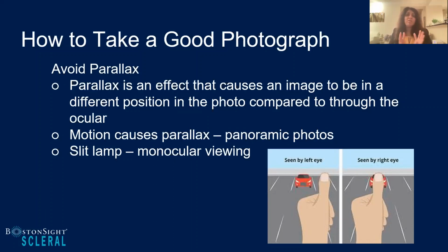The most important thing to know is that when you are looking at something through the slit lamp, take your image and then look at your image to make sure that everything was aligned correctly. So the placement of what you're looking at matches in the photograph to what you're looking at. Because the shifting of items in the photograph can happen, and that's what parallax is. You just don't want to get confused with a photograph and say, why is this here and it now looks here? You just want to make sure that your photographs do represent what you're actually looking at through the slit lamp. Yeah, I agree.